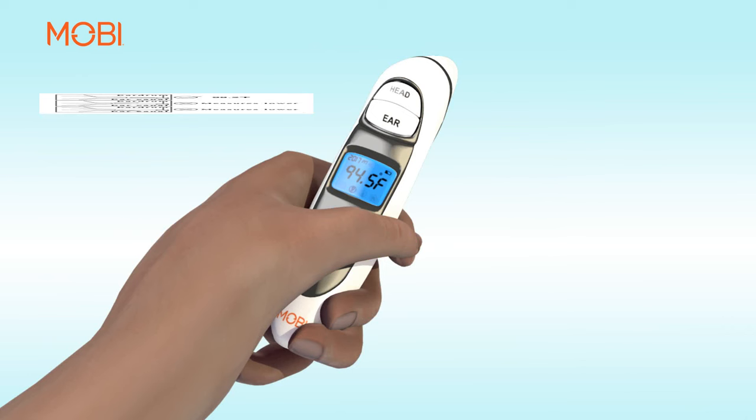Once you hear a short beep, the body temperature will be displayed in either Fahrenheit or Celsius, depending on the setting.